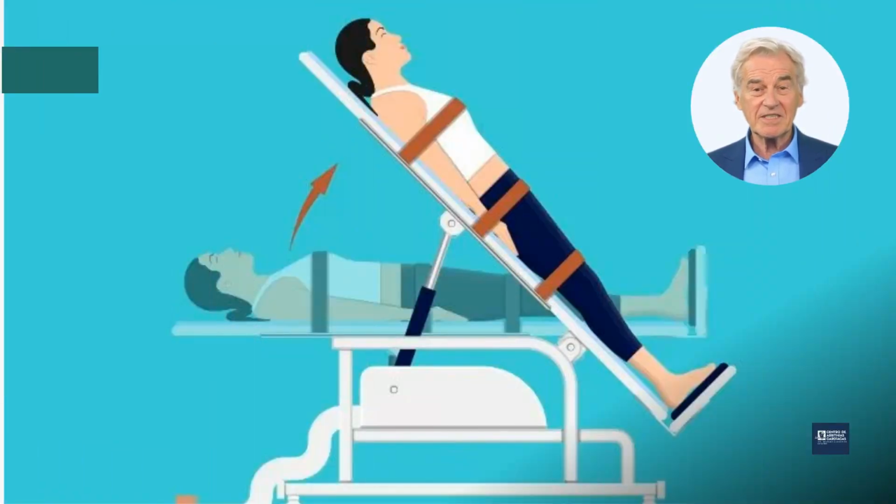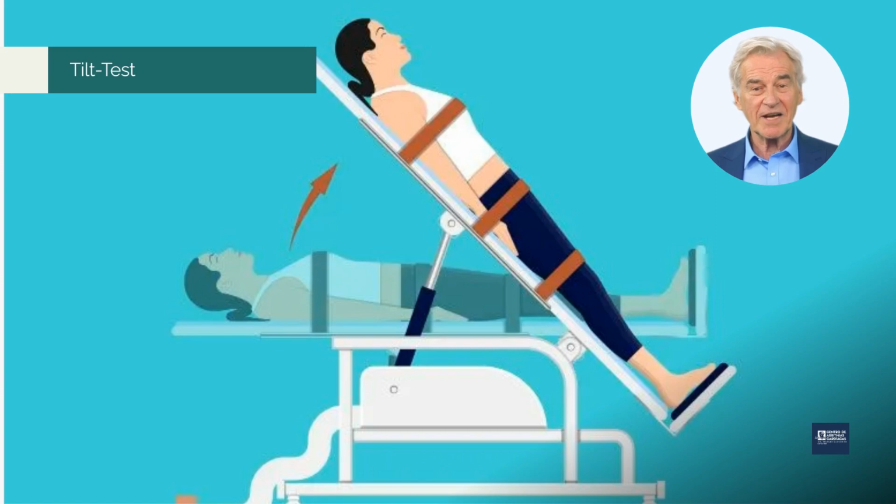The tilt test is a non-intrusive examination that requires the patient to lie on a specialized bed, which is then inclined to a 70-degree angle. Throughout this procedure, both the heart rate and blood pressure are closely monitored at various intervals. The objective of this test is to simulate conditions under which the patient may experience symptoms like dizziness or fainting, thereby enabling a thorough evaluation of the body's physiological response.